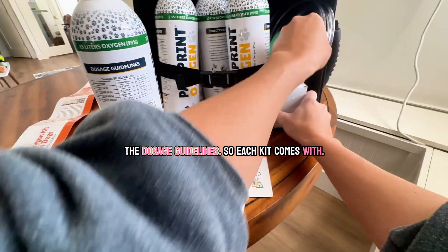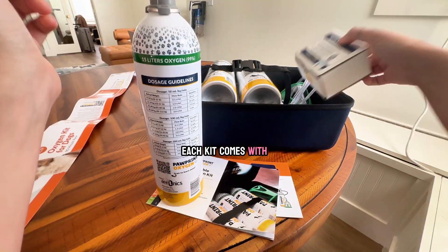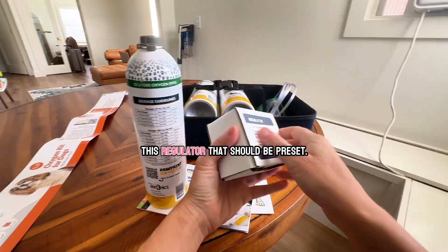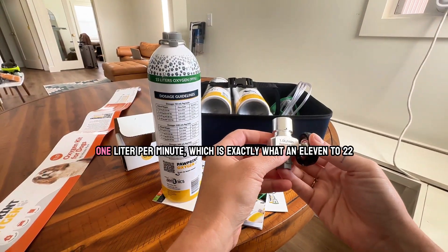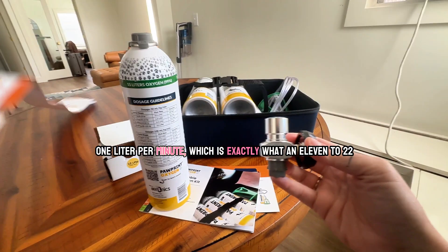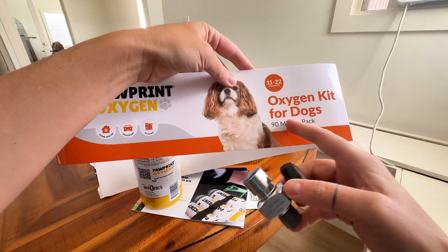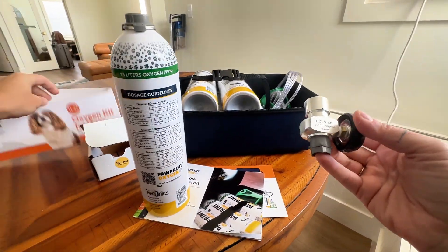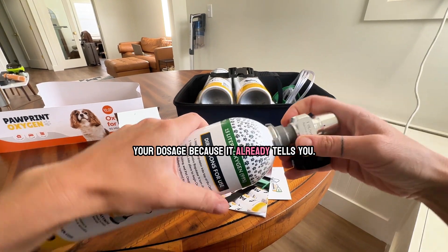Each kit comes with this regulator that should be preset — one liter per minute, which is exactly what an 11 to 22 pound dog needs. So this is preset and it kind of takes out the guesswork of your dosage because it already tells you.